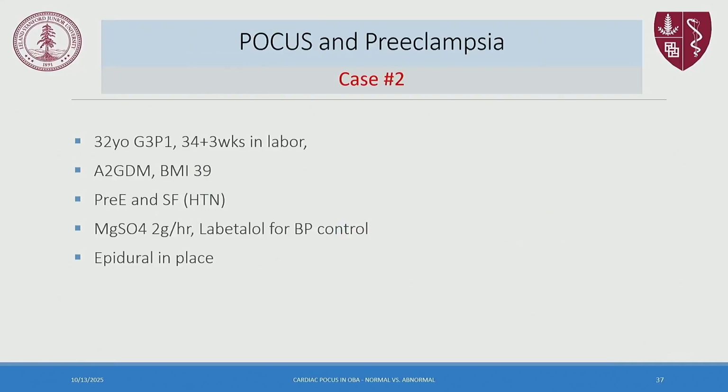And then let's get to our last case. We have a preeclamptic patient with severe features. She's on magnesium. She has an epidural in place, is in labor.